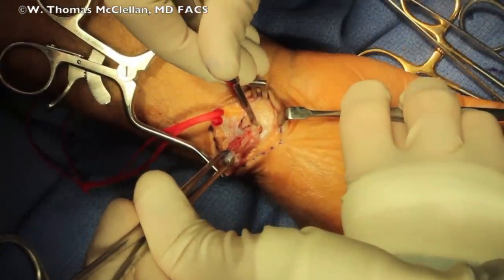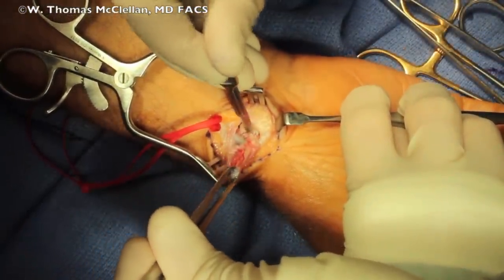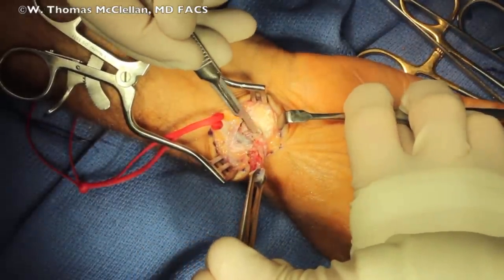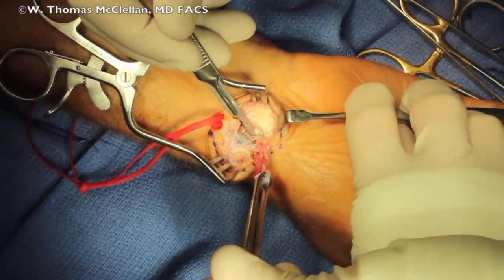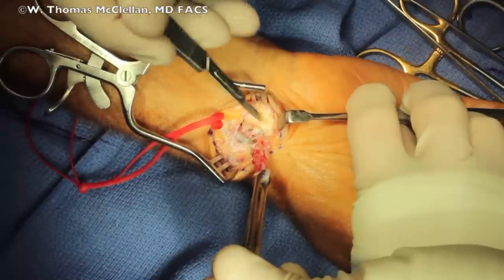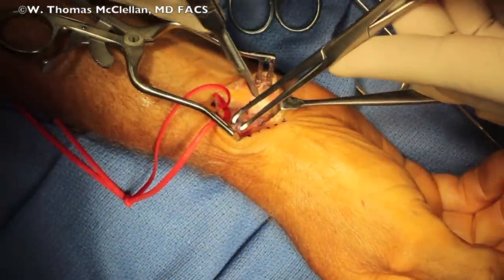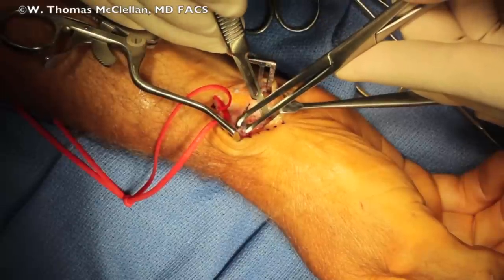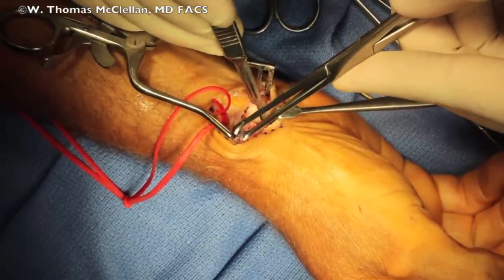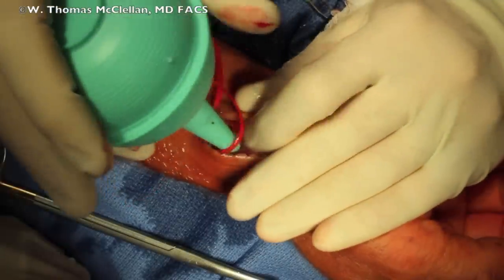I continue the dissection down onto the wrist joint itself. As I get closer to the wrist joint, I'll dissect out the stalk of the ganglion cyst with the 15 blade. Once I get the stalk all the way down, I'll take out a small window of joint capsule with the 15 blade. And the cyst is removed.